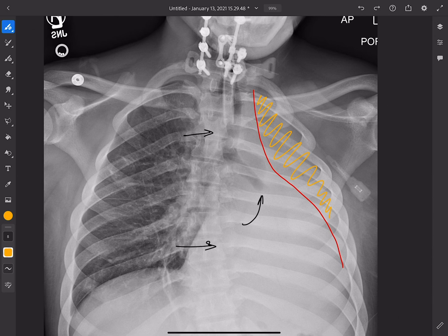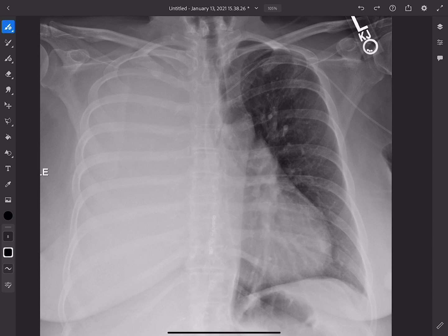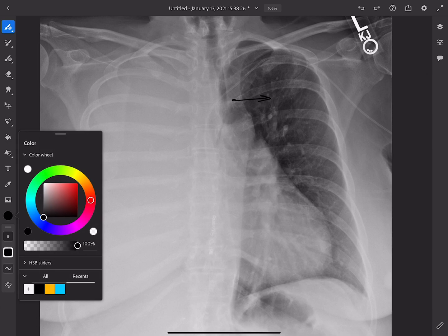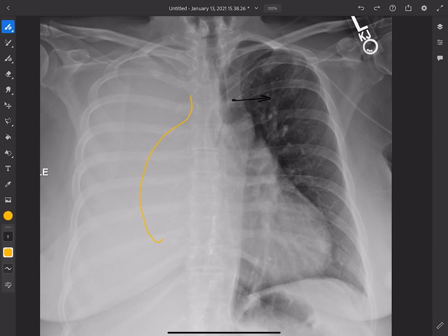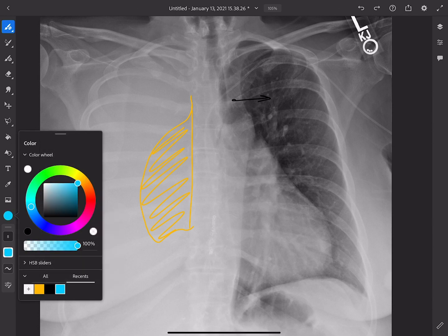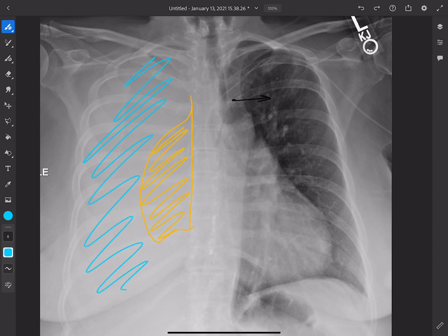In this second case, we have another complete whiteout, but notice that the trachea is shifted to the contralateral side of the opacification. That tells us that not only do we have lung collapse, but we also have a large pleural effusion. Although we can't see the delineation between the pleural fluid and the lung, the lung is likely collapsed around the hilum, and we don't even see air bronchograms in it. The rest of the opacity is due to pleural fluid — so again, a collapsed lung but without a pneumothorax.